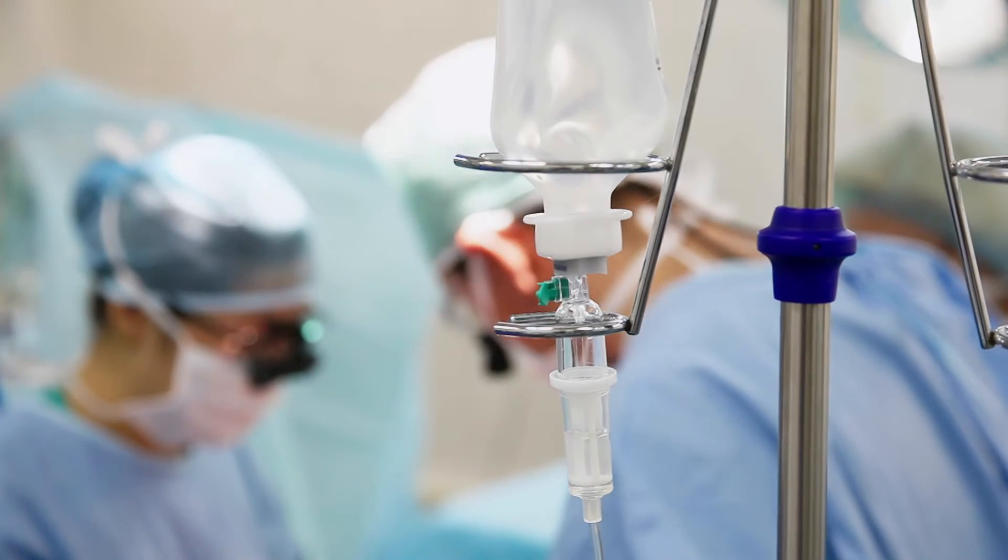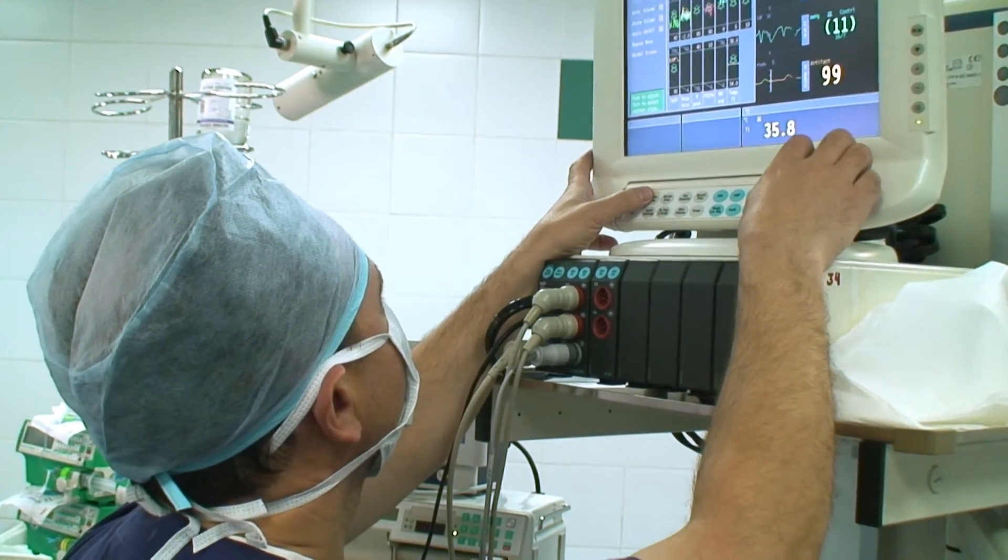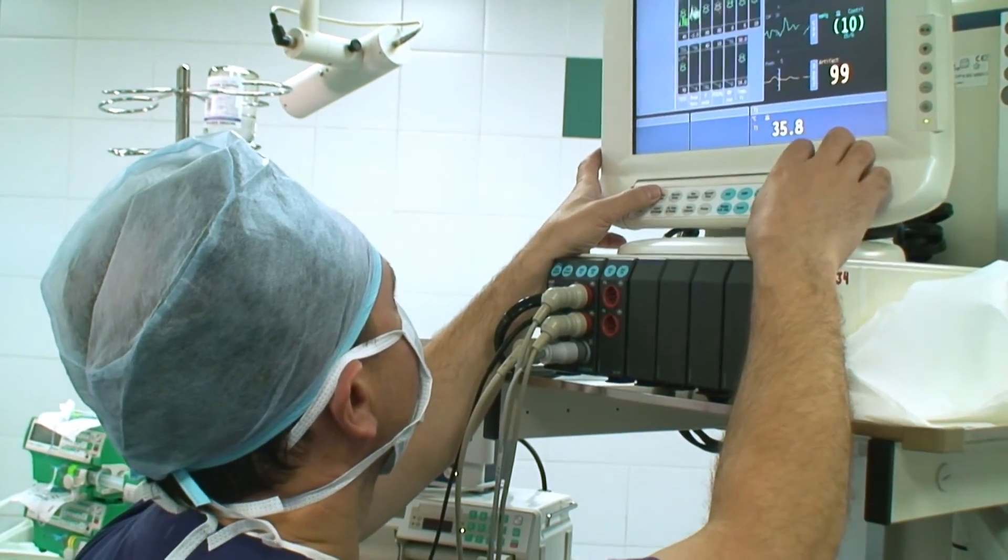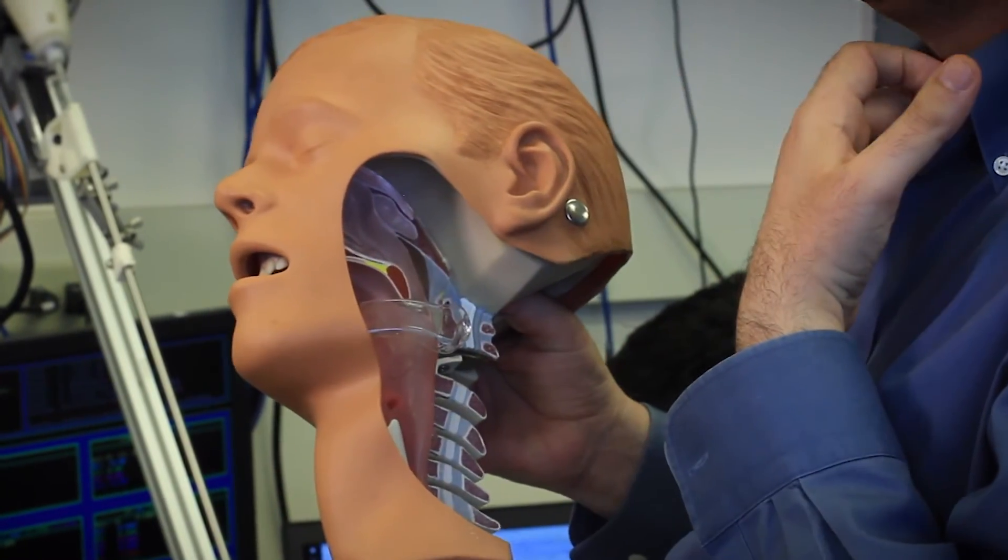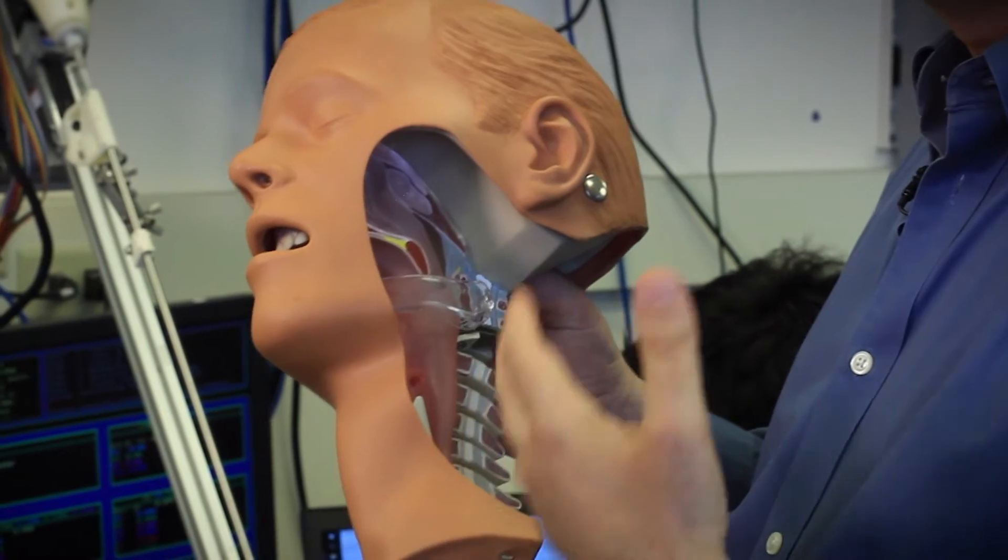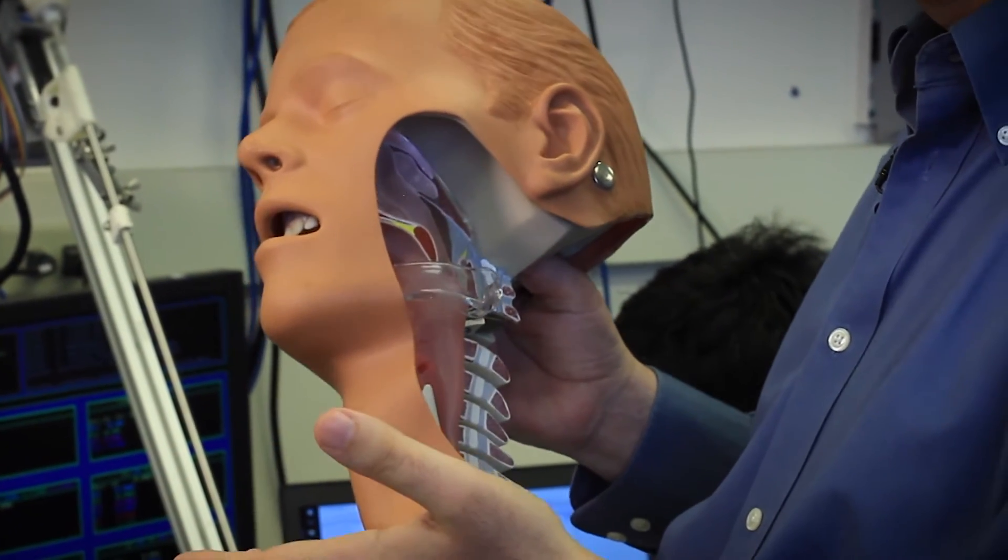The old procedure can sometimes cause injury. Now you have to undergo full anesthesia. You have to go into full operating room setup. You'd have to insert a tube through the mouth that generally butts against the teeth and helps keep the jaw open.